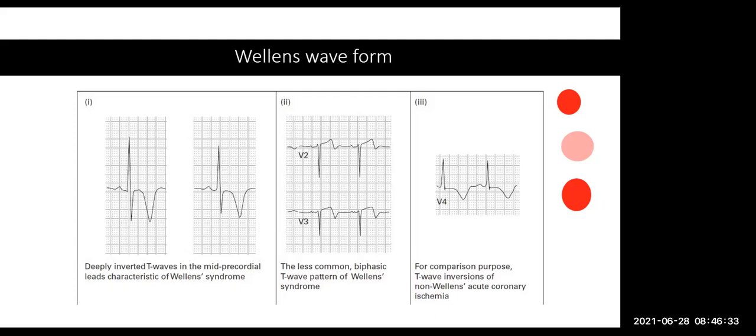Because now you've got a pain-free patient sitting there, everything looks okay. No, it's okay, don't worry, we'll put you in the ward, and you've killed the patient. That's the thing. When I say it's relatively uncommon, it is relatively uncommon, but we do see it. It's not like you'll never see it. Just keep in mind these deep inverted T waves. Just remember that. And when it does happen, even if you can't remember exactly what it is, ask somebody and then we'll take it. Any questions?